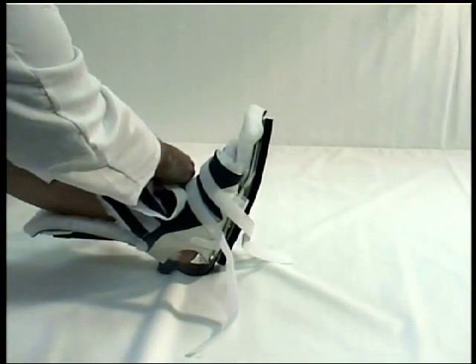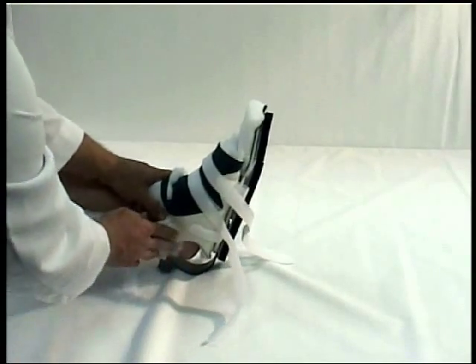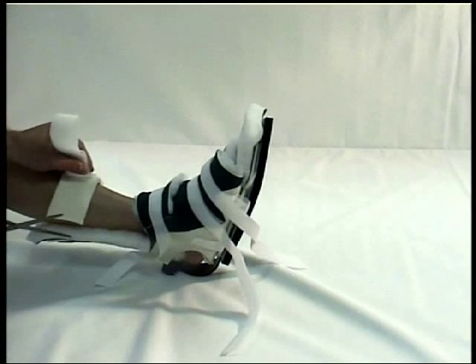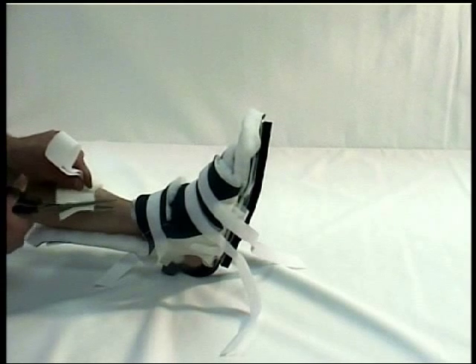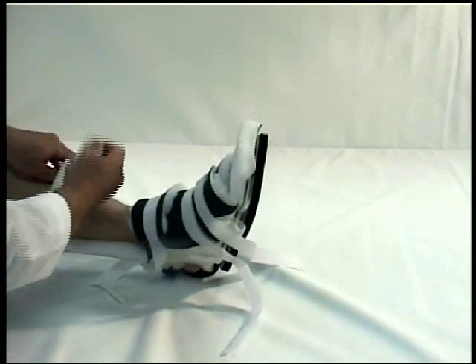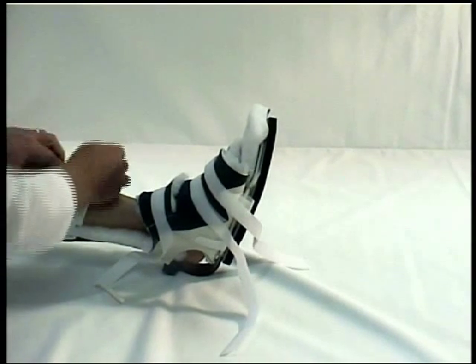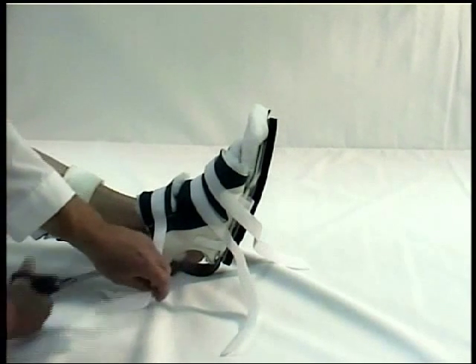If contact does occur, we recommend refitting the PRAFO or adding additional padding under the calf liner to offset this contact. To allow for a comfortable and stable fit, be sure to trim away any excess material on the felt calf pad before securing the calf strap against the patient's leg. Be sure to not overly tighten the calf strap to ensure circulation is not compromised. Proceed to then trim the calf strap and all remaining straps to finalize the custom fitting of the orthosis.